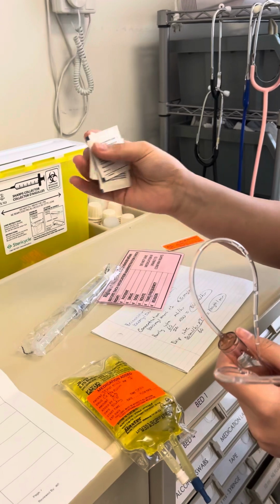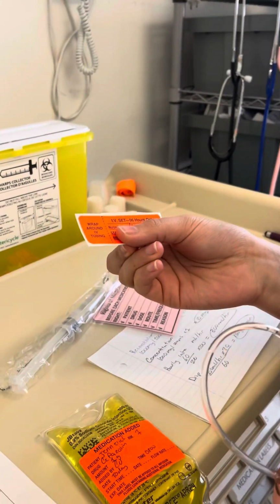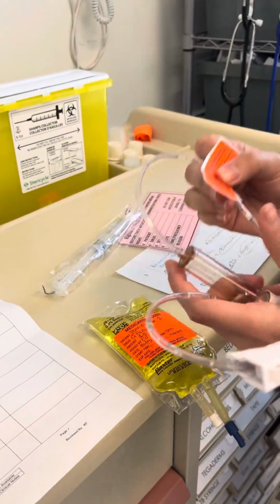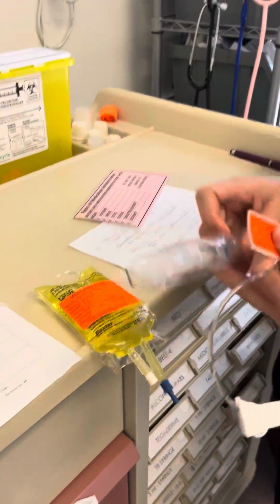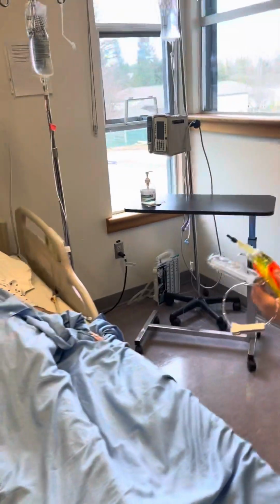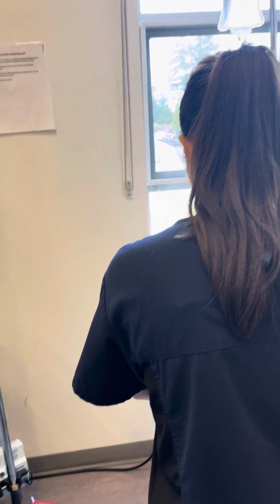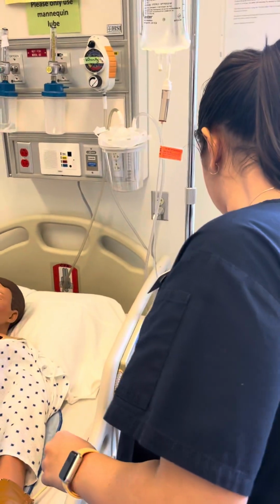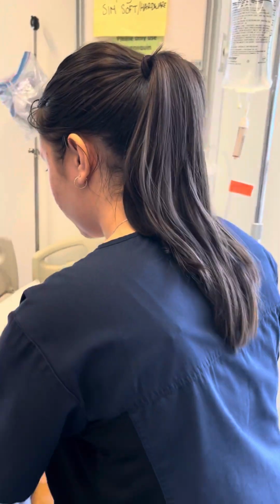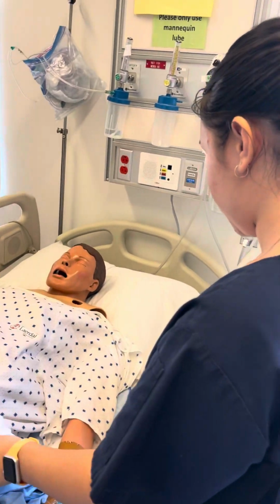I'm gonna take some alcohol swabs with me, my IV line label to put on this when I set it up, saline, the medication. I'll take all of this with me. Okay, we'll go over to the bedside. Like I said, introduce myself, explain the procedure. Check ID. Generic, yep, date's right. Okay, perfect.